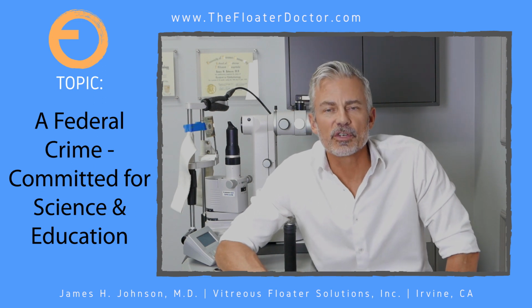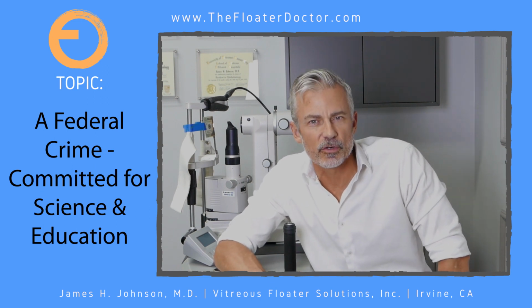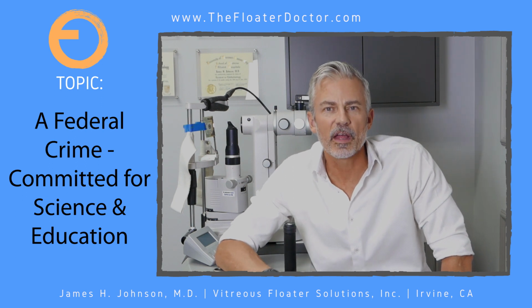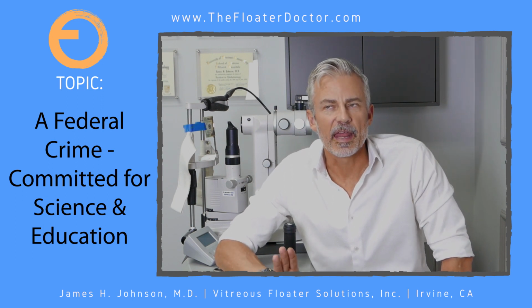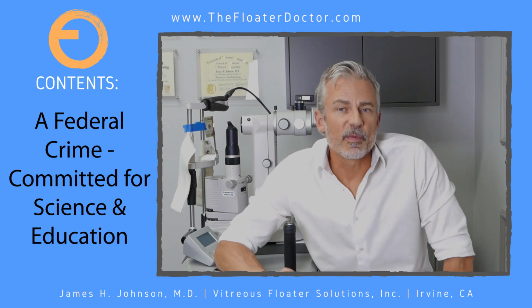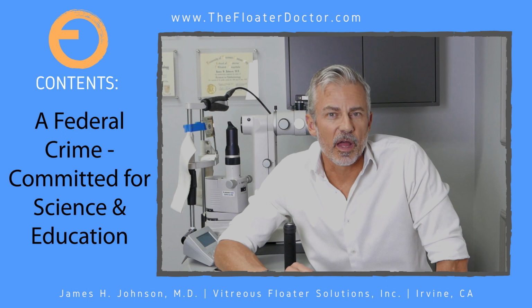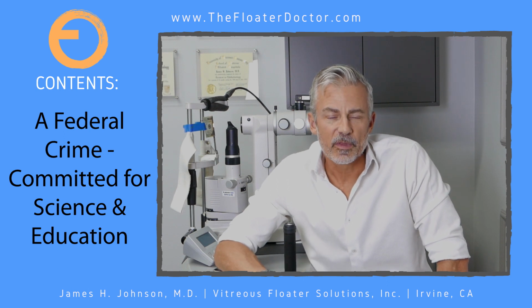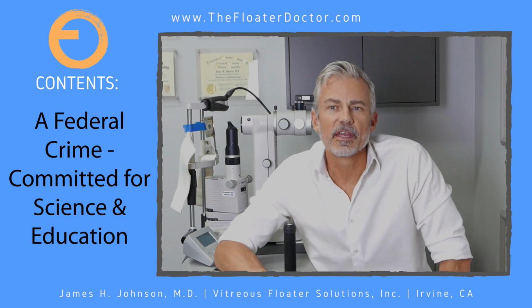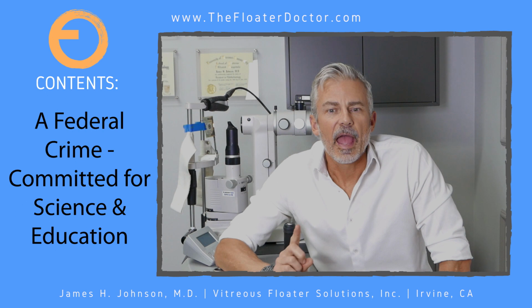Hello, I'm Dr. James Johnson. I am Medical Director of Vitreous Floater Solutions. I am also known as the Floater Doctor because all I do is treat eye floaters, and I've been doing so since 2007. Today we're going to learn about the accuracy of the YAG laser when applied to the floaters in your eye. We're going to talk about the dead-on accuracy, and the low level of energy that we use, all in treating eye floaters.